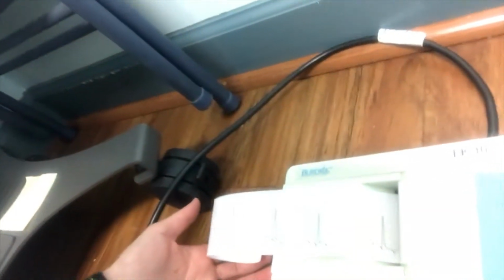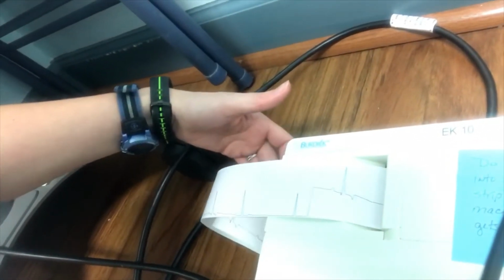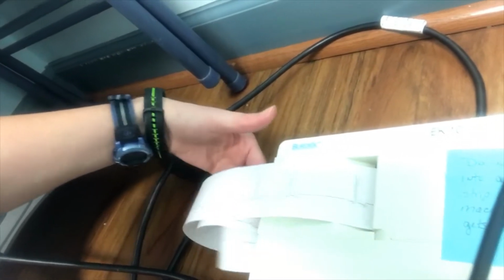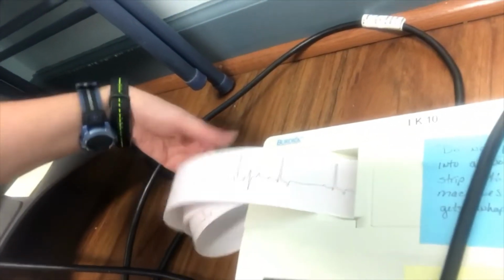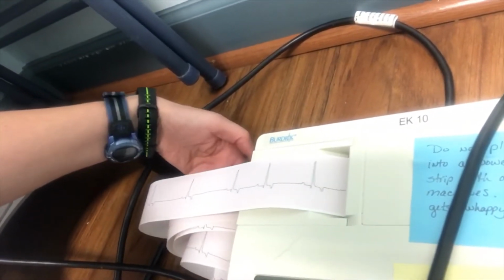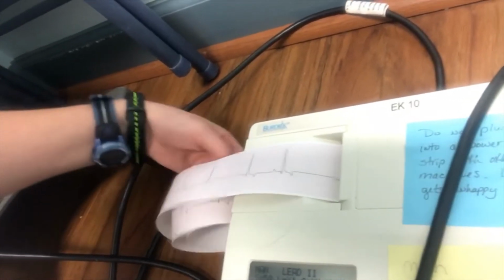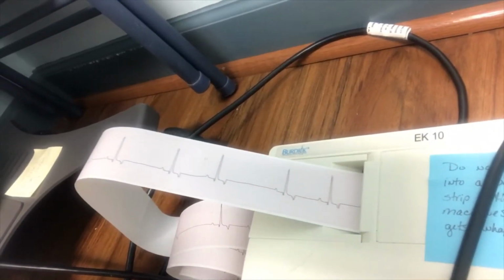There you go, those are coming out a little bit more even on our strip here. That way we can get a more accurate reading and interpretation of our EKG. So things that we'll be looking for, once I get it long enough here, we'll stop it and then we'll be able to analyze it.